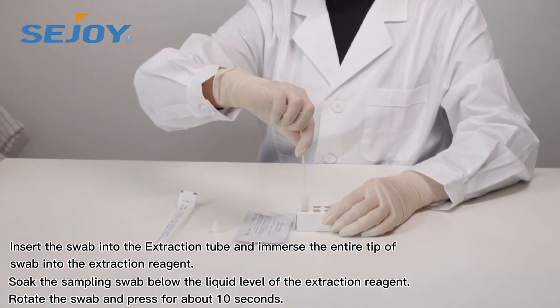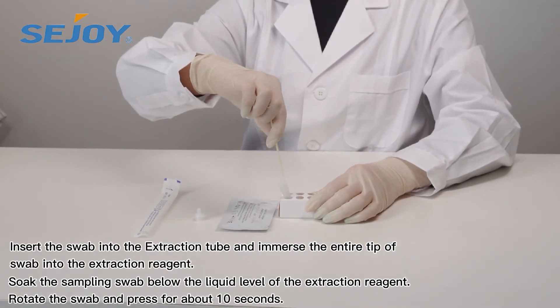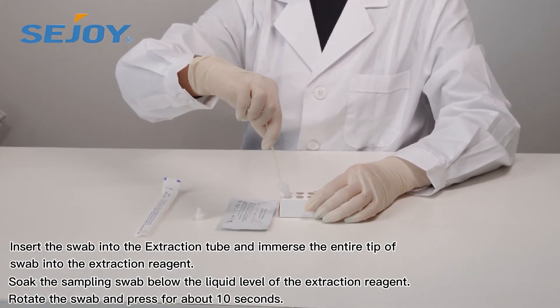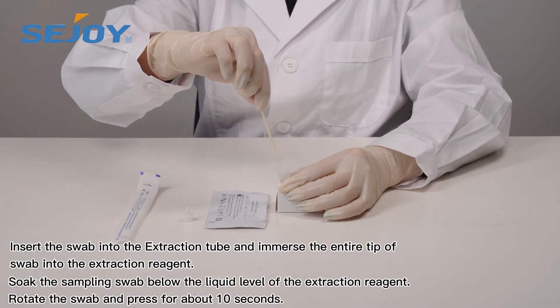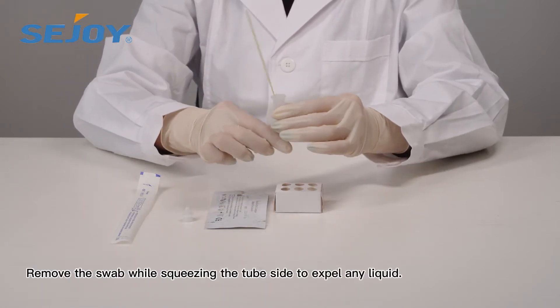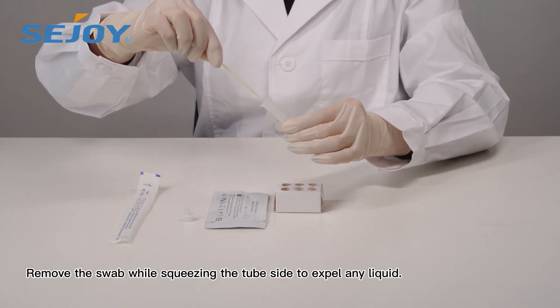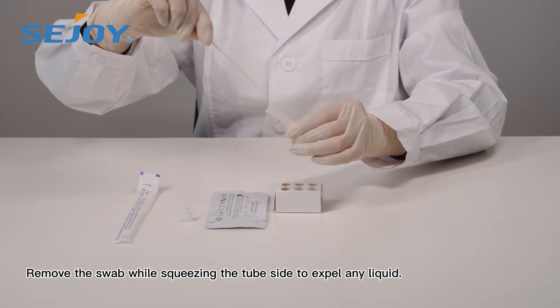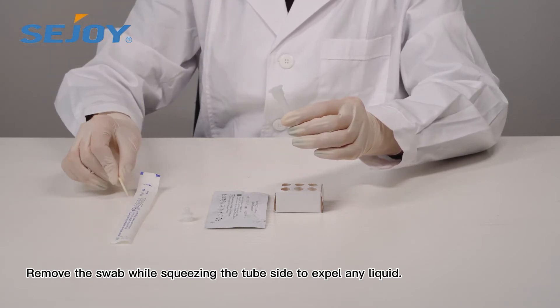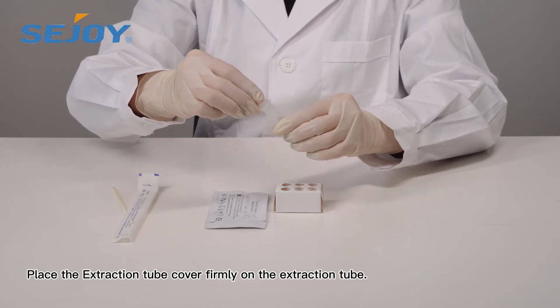Insert the swab into the extraction tube and immerse the entire tip of the swab into the extraction reagent. Soak the sampling swab below the liquid level of the extraction reagent. Rotate the swab and press for about 10 seconds. Remove the swab while squeezing the tube sides to spare any liquid. Place the ejection tube cover firmly on the extraction tube.